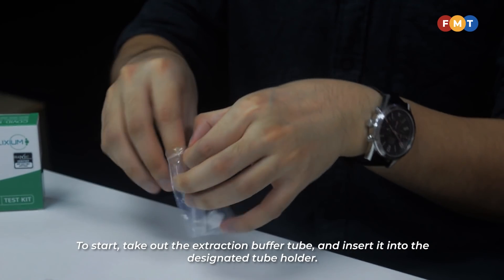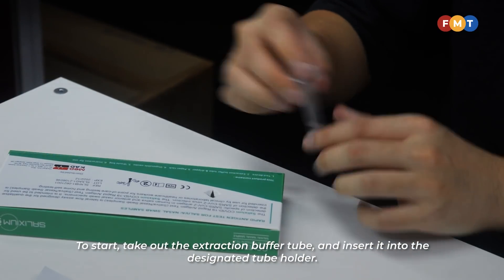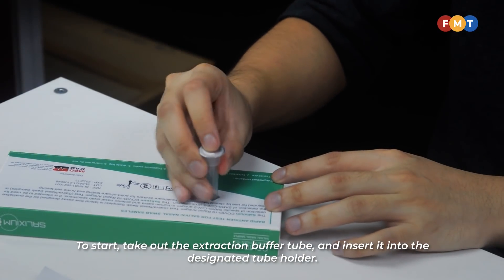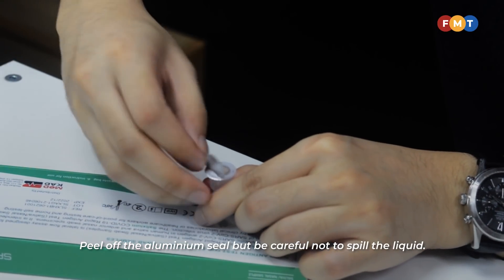To start, take out the extraction buffer tube and insert it into the designated tube holder. Peel off the aluminum seal, but be careful not to spill the liquid.